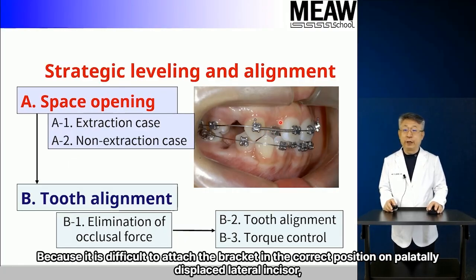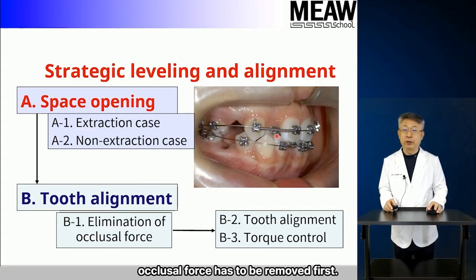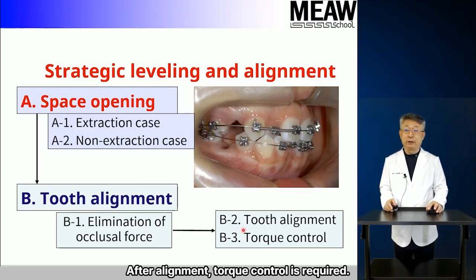Because it is difficult to attach the bracket in the correct position on palatally displaced lateral incisor, occlusal force has to be removed first. Then the teeth are re-leveled. After alignment, torque control is required.